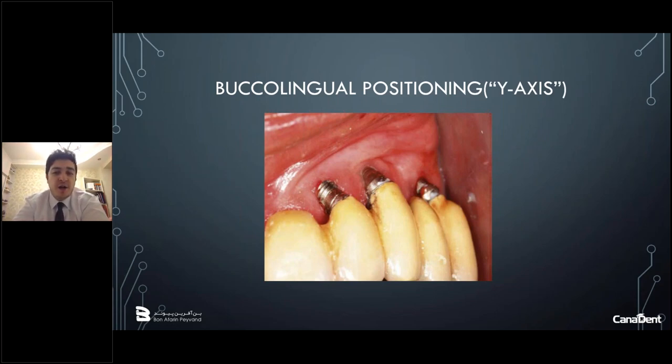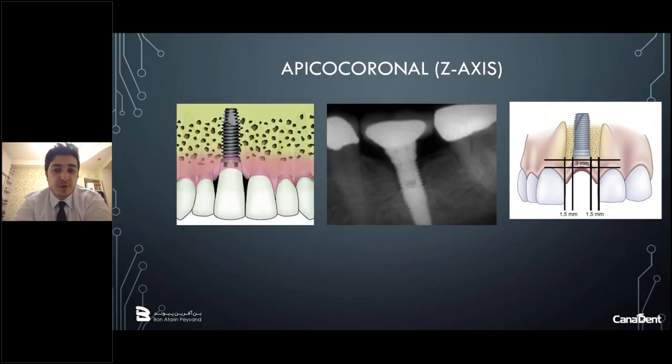In the anterior region, the ideal angulation for an FP1 or FP2 in the anterior is slightly lingual to the incisal edge. So it would not be that the center of the implant comes straight at the incisal point. It must be a little lingual and preferably, for the upper incisors, at the cingulum. But in the posterior region, the long axis of the implant should emerge within the approximate central fossa of the prosthesis for a screw retained or cement retained FP1 or FP2.